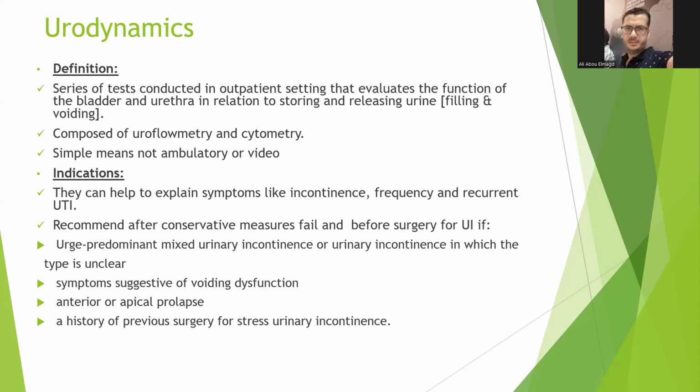the bladder and the urethra in relation to storing and releasing the urine. It means the filling and voiding phases. And it is composed of two parts, which are uroflowmetry and cystometry. We will talk in detail about each one. Simple means it is not video or not ambulatory.